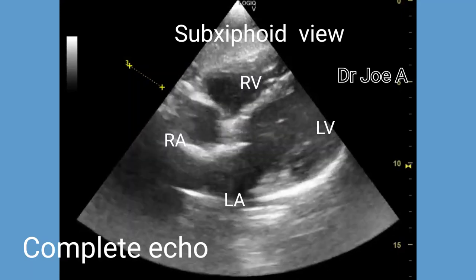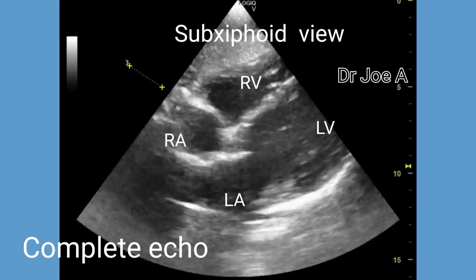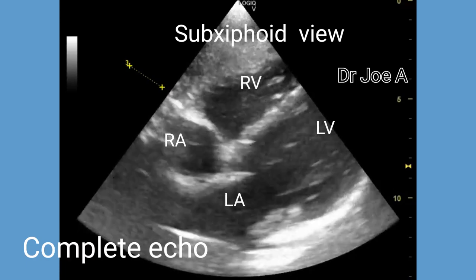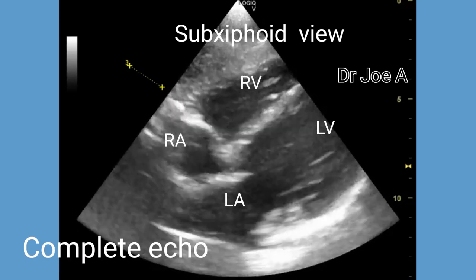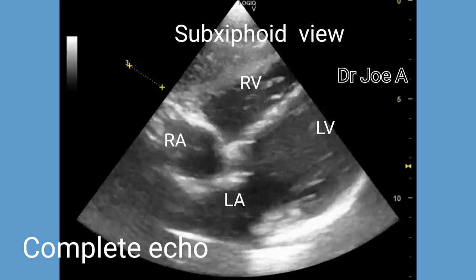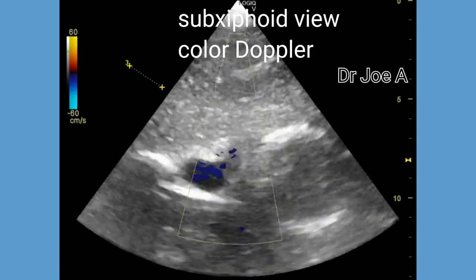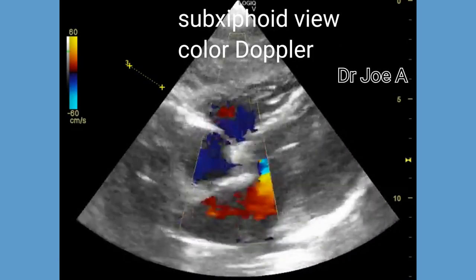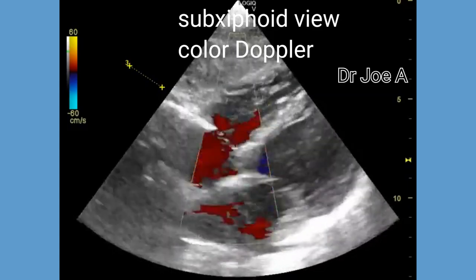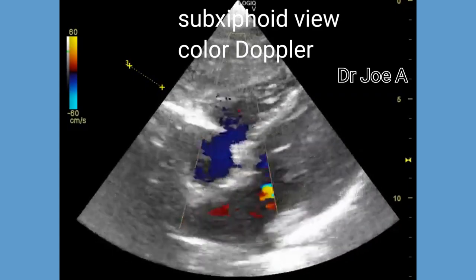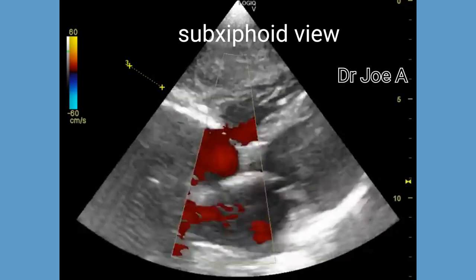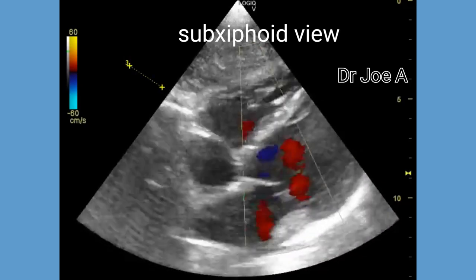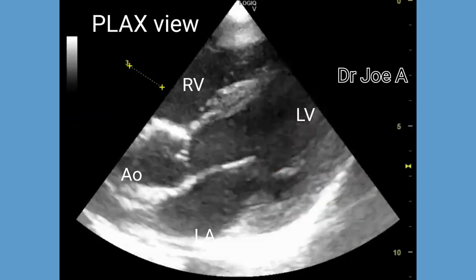This is an echocardiography showing the different views to study the heart. We begin with the sub-xiphoid view, which shows all four chambers of the heart. Color Doppler study of the sub-xiphoid view shows blood flow across both the tricuspid and the mitral valves. Flow was normal.